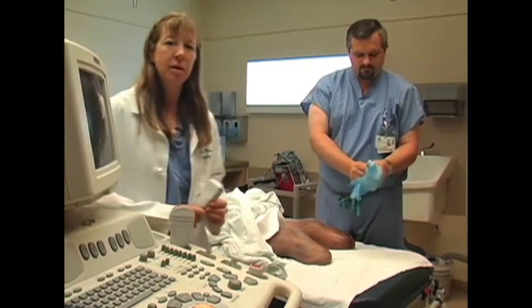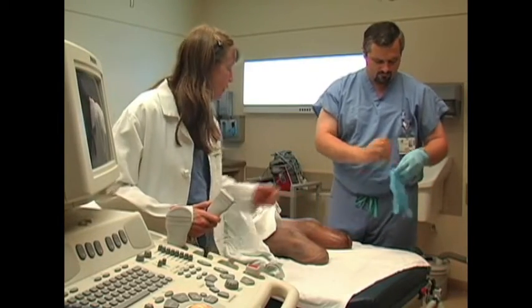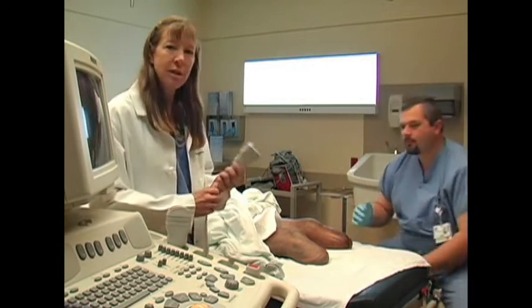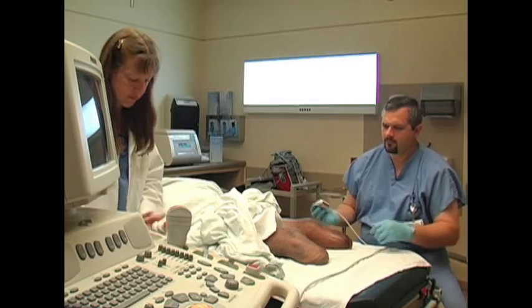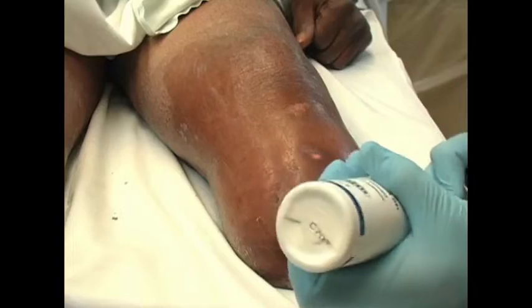Our patient came in, he's a bilateral lower extremity amputee, and he has one swollen stump. So our goal is to discover whether there's an abscess or cellulitis in that area. We'll be using a linear high-frequency transducer, and we'll first apply gel to the area.